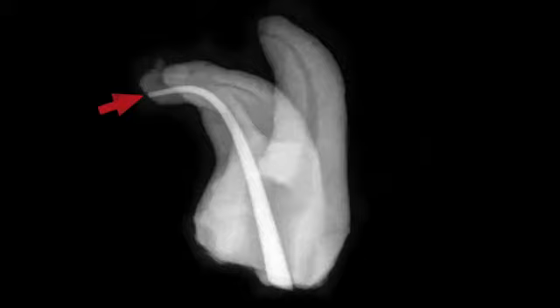Cone fit is a unique art in itself. The longer, more curved, and thinner the canals, the closer one wants to fit the cone. The straighter, wider, and shorter the canals, the further away the cone fits. So what would I do here? I would cut this typically back 1 millimeter for a vertical compaction of warm gutta percha, and if you're making a carrier base, you would make your length 1 millimeter short of that finisher that we used to transfer the length a moment ago.